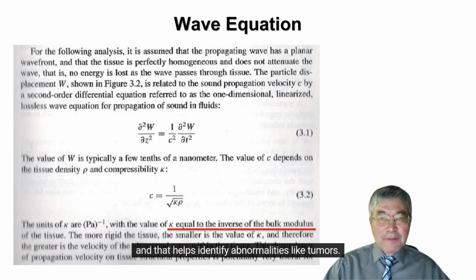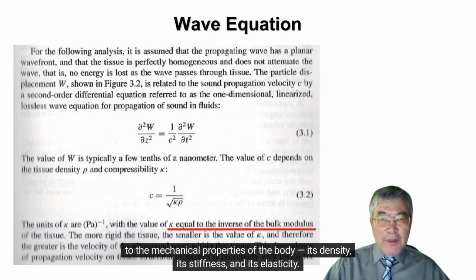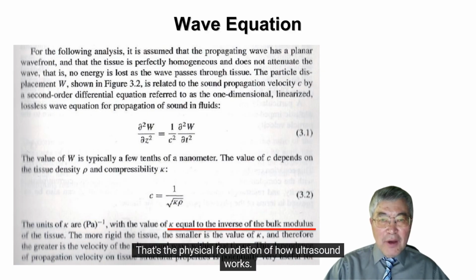abnormalities like tumors. So this simple equation, the wave equation, doesn't just tell us how sound moves, it also connects directly to the mechanical properties of the body, its density, its stiffness, and its elasticity. That's the physical foundation of how ultrasound works.